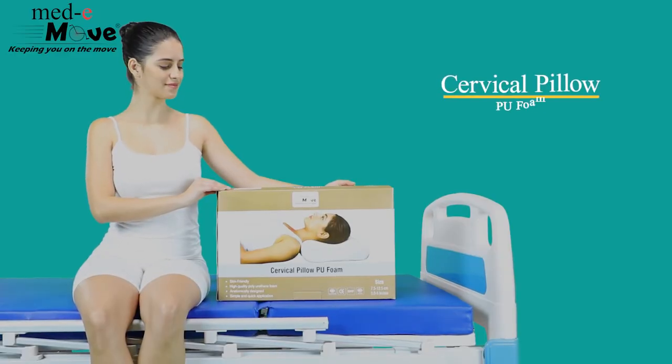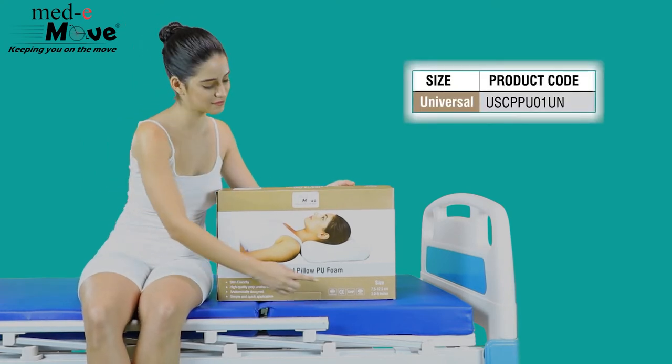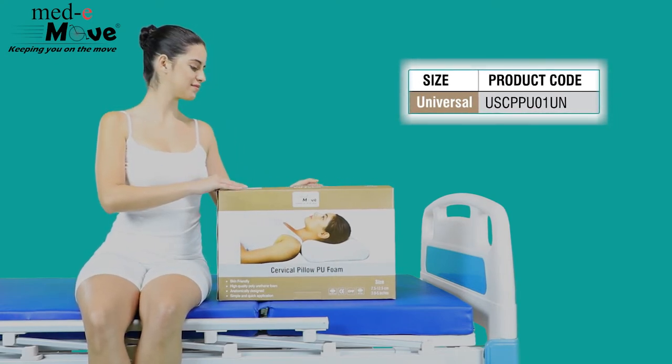Here we will demonstrate how to use Medimove Cervical Pillow Polyurethane Foam. The Cervical Pillow PU Foam is available in universal size, which means one size fits all.